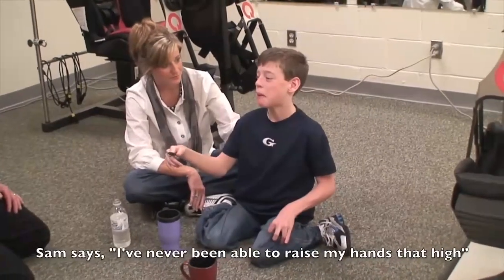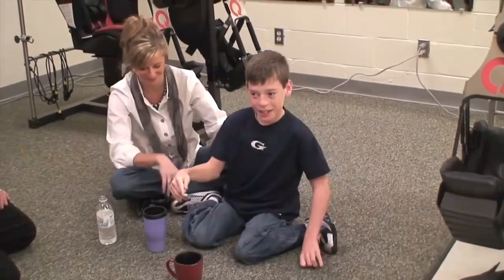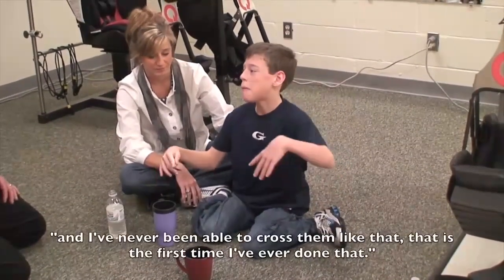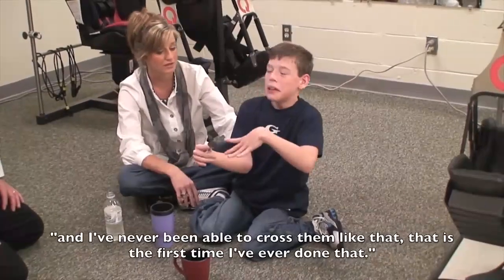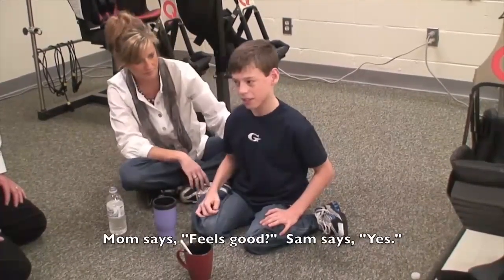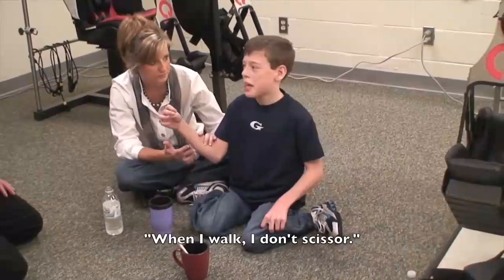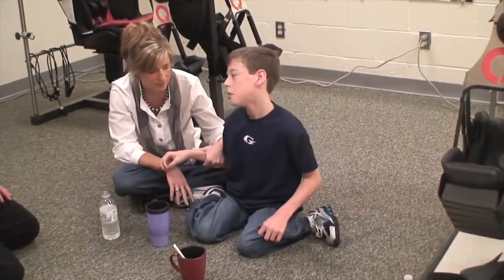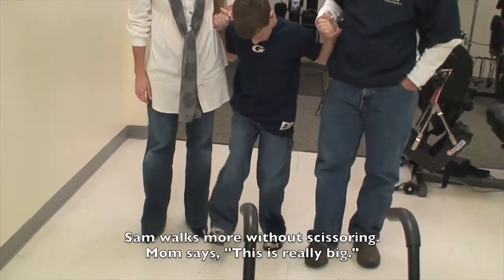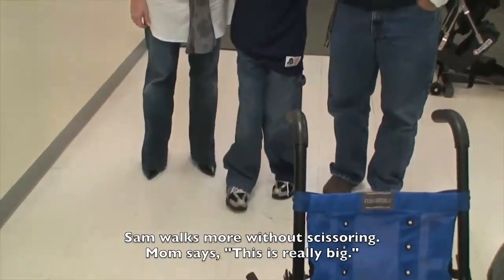I've never been able to raise my hands up. It's an emotional thing. You've never been able to cross them like that — and that's the first time I've ever done that. The patient says: it feels good. Like when I walk, I don't scissor. Your feet are straight, Sam. Look at the smile on his face — that is awesome. Scissoring is a big piece, and that's the first thing.